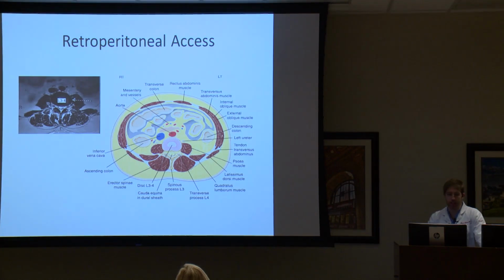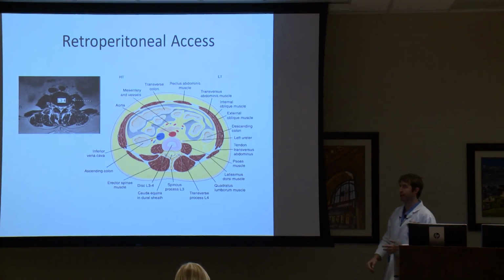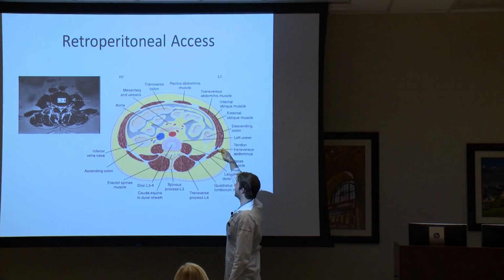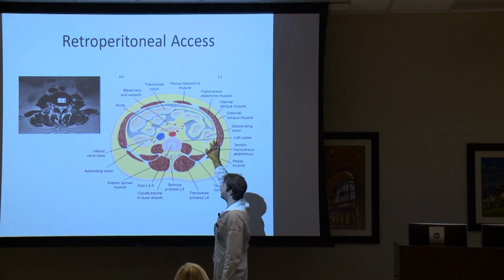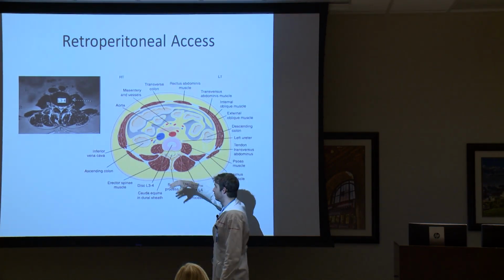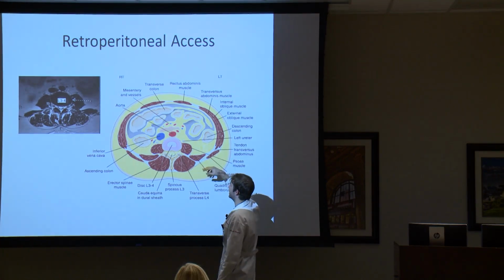As you can see from this picture right here, there's a lot of bad things in there, and so you want to avoid all that stuff and just go retroperitoneal. And so when you come down, you literally come in right where this thing is. You make a little incision right here. And once you get past this, you try and stay out of the peritoneum, which is what houses all the bowel and bladder and all that kind of stuff.